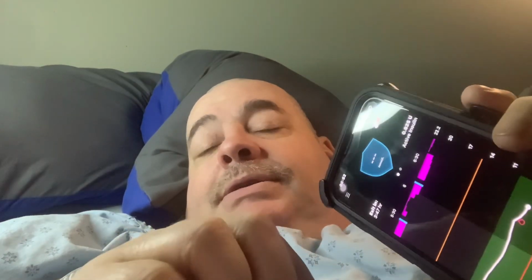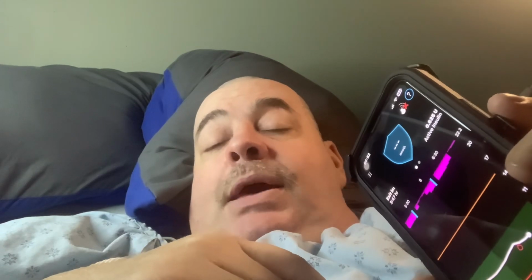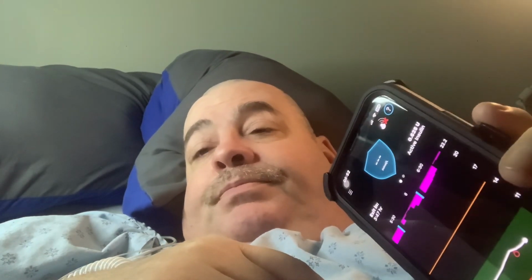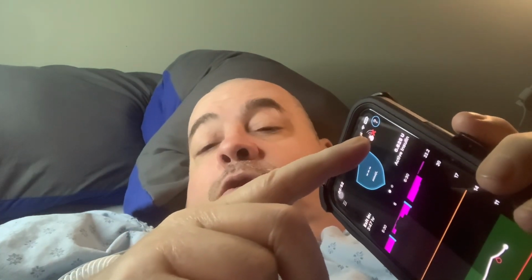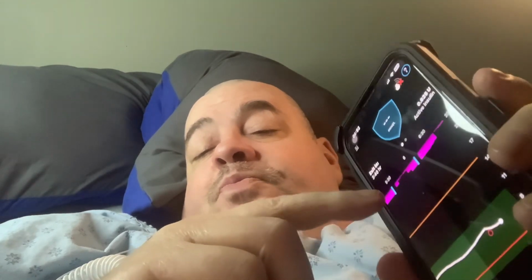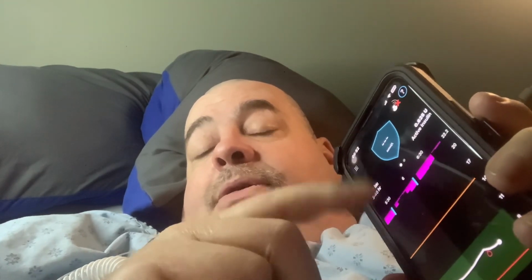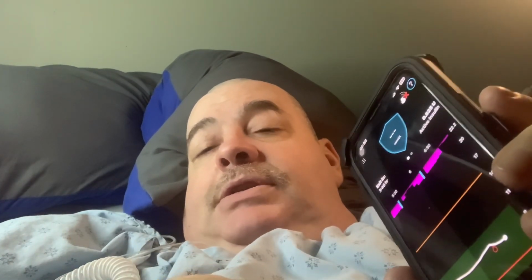Part of wearing a CGM is every 7 days you have to change it. And there is some downtime. That's shown by here that you don't have a sensor connected. The pump still works fine while you're changing the sensor.